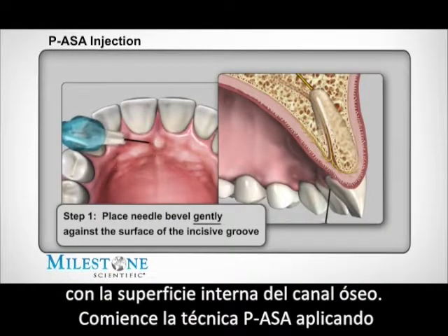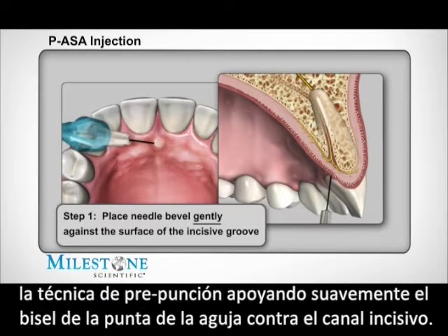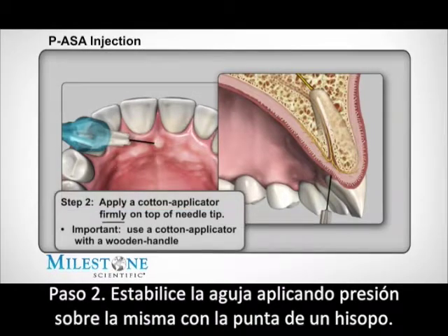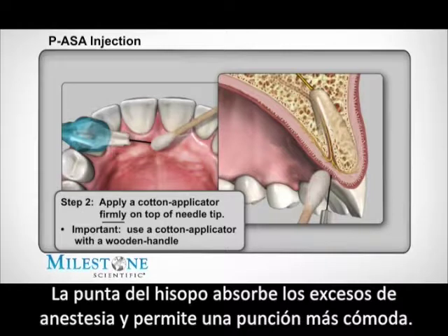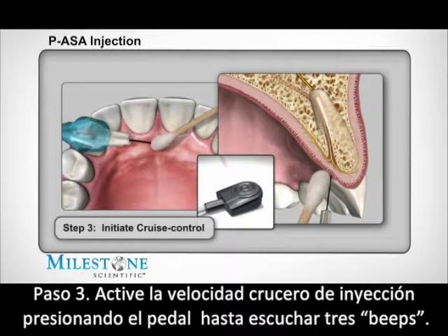Start the PASA injection by using the pre-puncture technique. Step 1: Gently place the bevel of the needle against the surface at the incisive groove. Step 2: Stabilize the needle by applying firm pressure from a cotton applicator. It's best to use a wooden handle cotton applicator so that positive pressure can be applied. The applicator also absorbs any excess anesthetic solution and makes for a more comfortable needle entry.